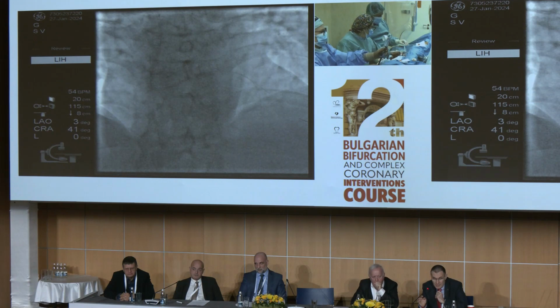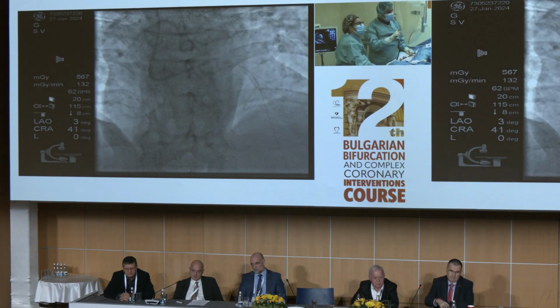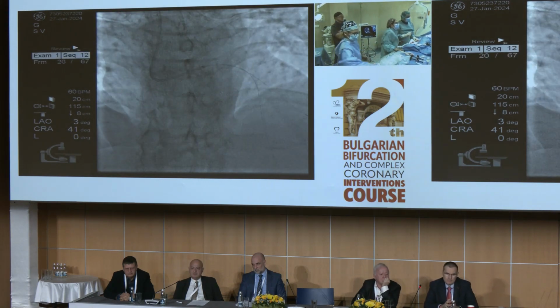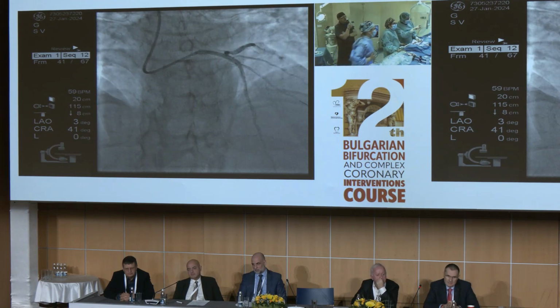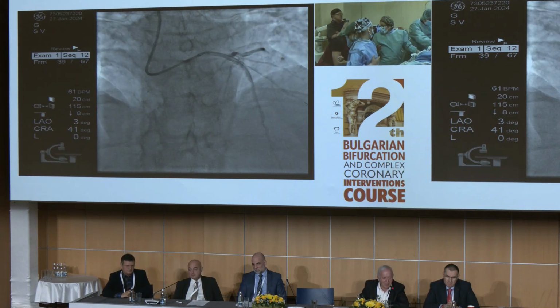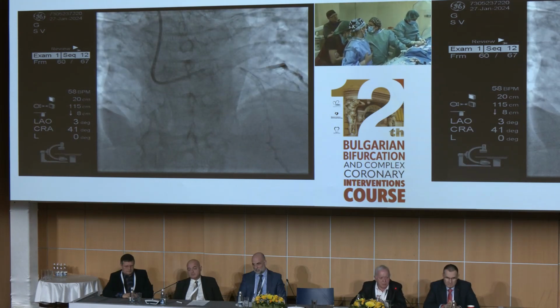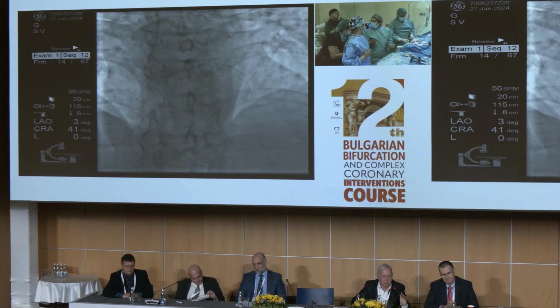I'm really surprised, and I'm really impatient to see how this result looks in IVUS. There is a lot of explanation, but finally I don't have any practical issues with this, because we should achieve a good apposition or a good stent area by IVUS, which is clearly necessary for good immediate and long-term results. There should be an explanation, probably because there is a lot of calcium. Probably the vessel is not as circular as it needs to be. So maybe it's an important sign to correct.